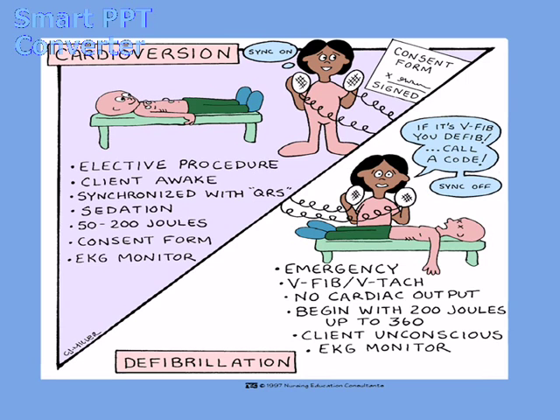We want to prepare our patients by getting an informed consent, making sure they have oxygen on them, document the rhythm they're in, make sure we have a crash cart on hand. They need an IV flowing. We're going to give them sedation. They're getting a shock. This is going to hurt. So we have to give them any anti-dysrhythmic that's prescribed, and other prescribed medications if the physician wants it.